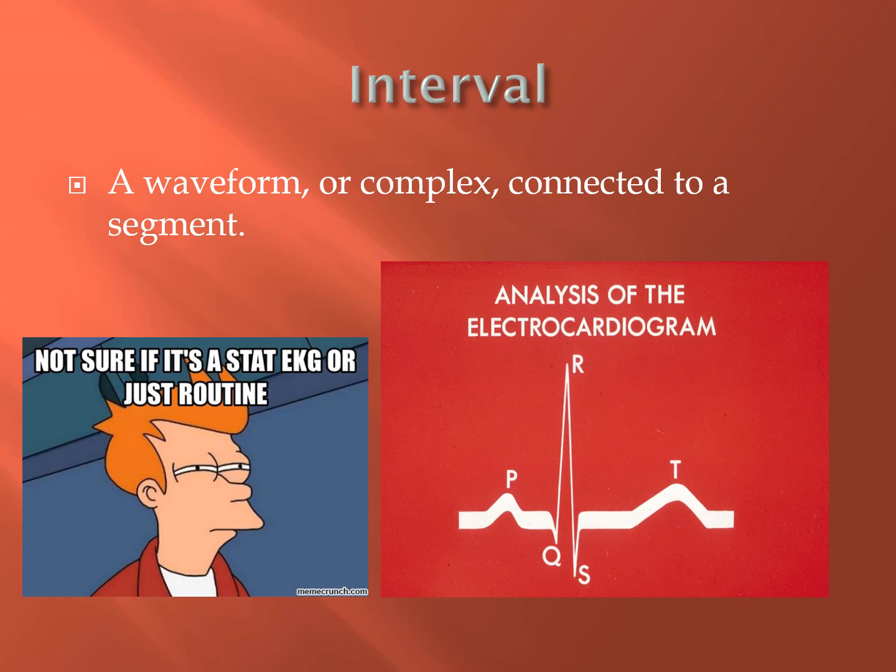The intervals. An interval is a waveform or a complex connected to a segment. So it's the analysis all together. The PR interval is something that we'll look at for certain things. The QT interval is something that we'll look at for certain things. So if we look at the PR interval, you see the distance between the P wave and the R wave. That's what we're looking at.